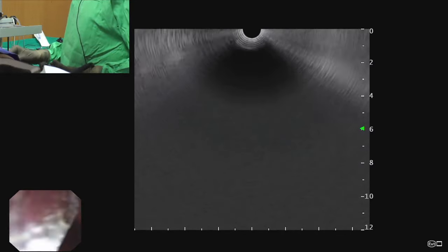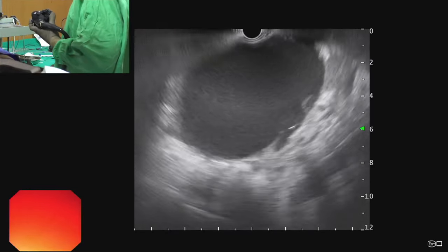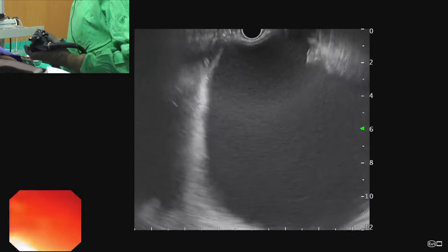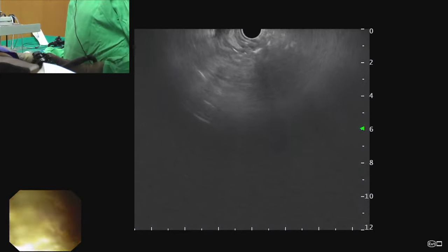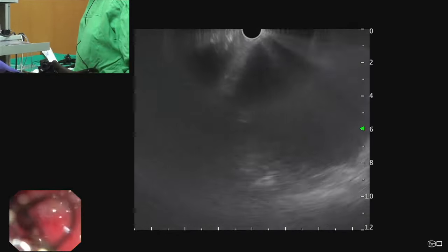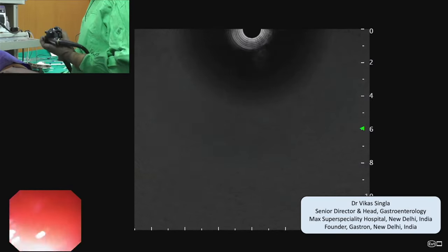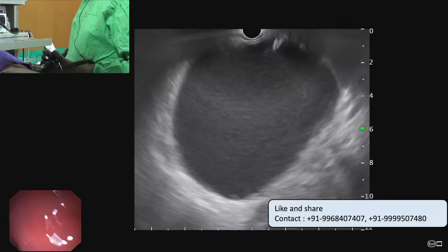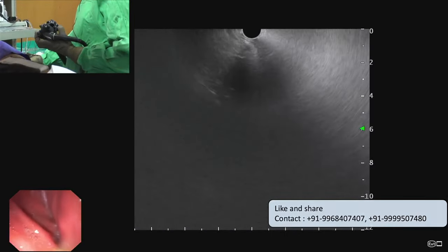First, we try to get a stable position. On the endoscopic image, we are in the proximal stomach, and when we apply clockwise torque we can see a large collection closely abutting the stomach with mainly liquid contents. We can try from a high lesser curve position or go slightly inside to the mid-stomach. For walled-off pancreatic necrosis, we can place either a plastic stent or a metal stent. This patient has mainly liquid collection, so a plastic stent should be good enough.